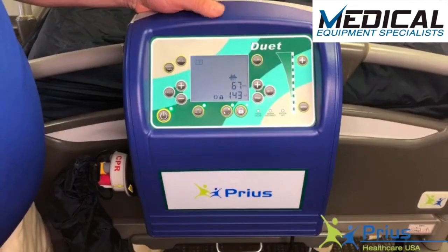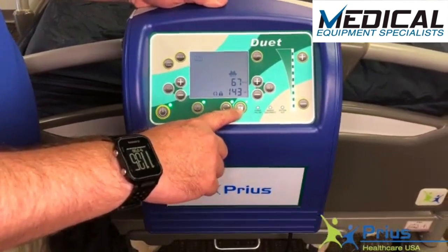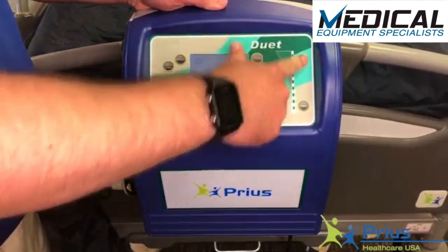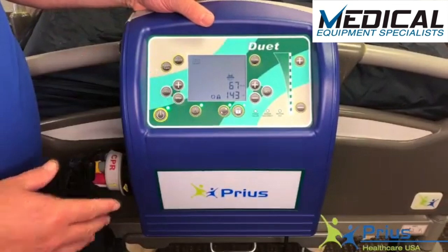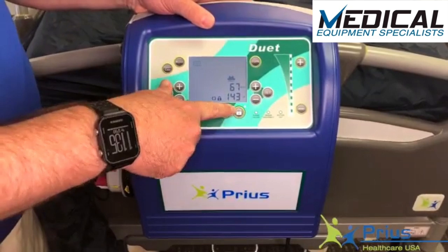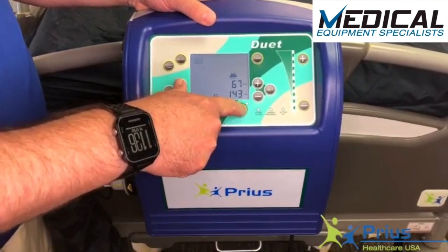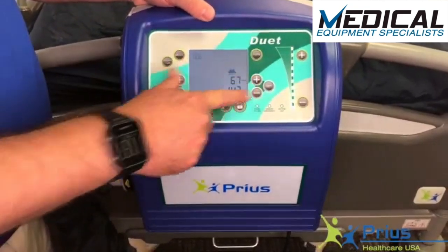One unique feature on the Duet mattress system is the auto-lock for the control panel. Any time the green light is illuminated above the lock button, I cannot engage any of the controls. It auto-locks after two minutes of inactivity. If you find yourself pushing buttons and nothing's happening, double-check that the lock is turned off. If it's not, push and hold the button for up to four seconds. When the green light extinguishes, you can alter your controls once again.